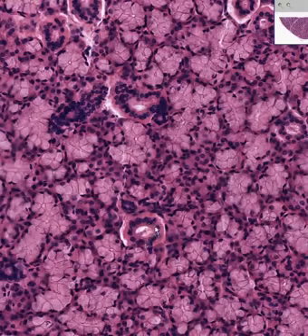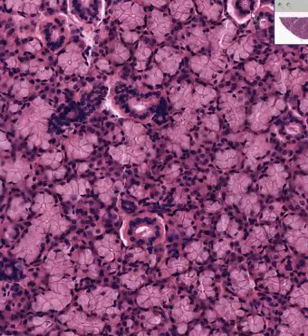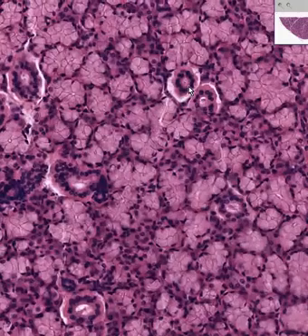Here's intercalated, here's intercalated. Here's striated, here's striated. This could be intercalated, this could be intercalated. Here's a couple of striateds, and all the rest of these are chiefly mucinous acini.